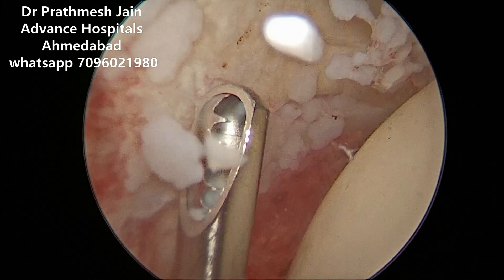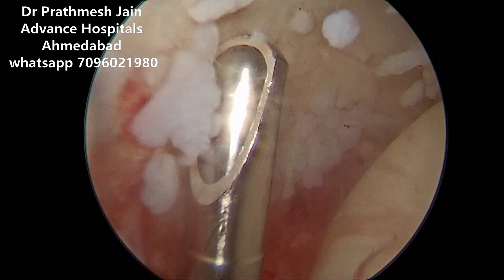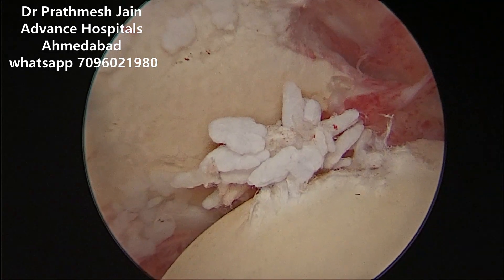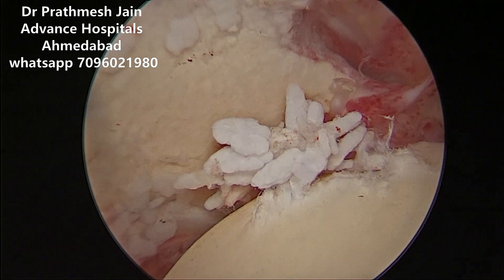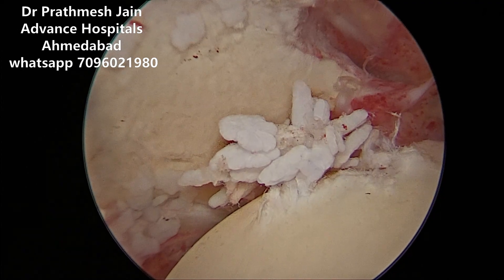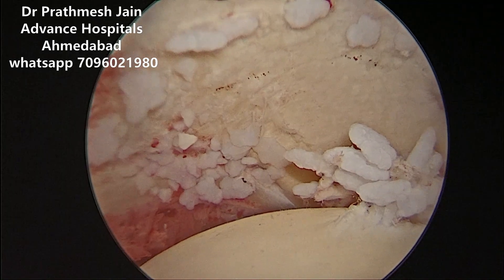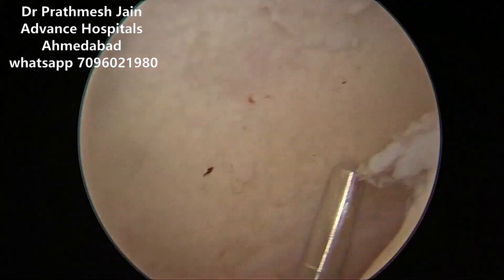Once you remove the synovial chondromatosis tissue, you will be able to see the cartilage loss it has caused at the center of the area. There is a small area of cartilage loss at the center of the hip cartilage which needs to be addressed thoroughly. These are small fragments of cartilage that need to be resected — this is a classical picture of a chondral lesion along with synovial chondromatosis fragments at the center of the hip cartilage. Once you are in with the shaver, be very careful and watchful. You need to remove all the fragments thoroughly to achieve a very good resection.